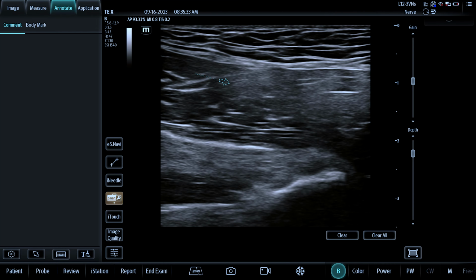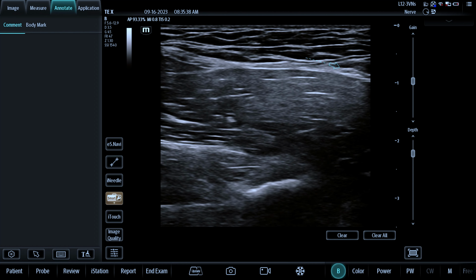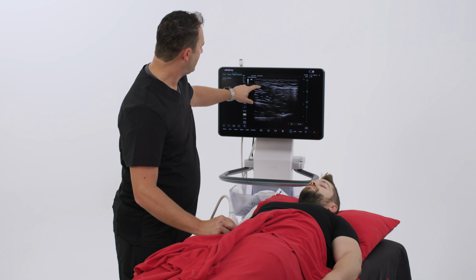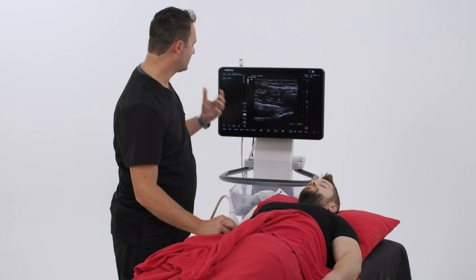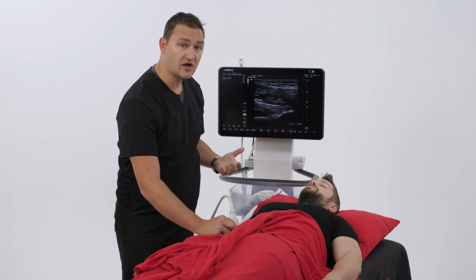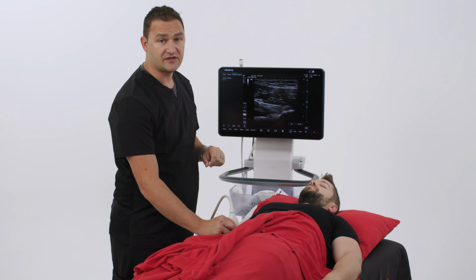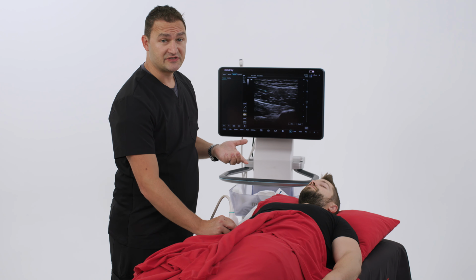So it can be really confusing to see this bow tie sign, especially in an older patient, because the internal oblique muscle is not going to look just like your sartorius muscle. Don't let that fool you. This is why I like going transsartorial, because once you pierce through the fascia iliaca, you're in the plane. You can dump all your local anesthetic there. Again, this is going to be a volume block, so you want to use between 30 and up to 50, sometimes even 60 cc's of dilute local anesthetic to get the block that you want in order to block the femoral nerve, the obturator nerve, and the lateral femorocutaneous nerve.